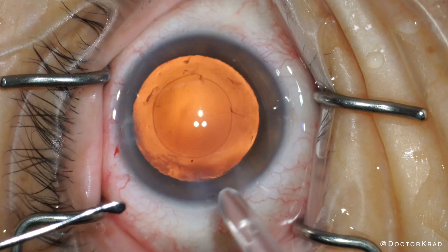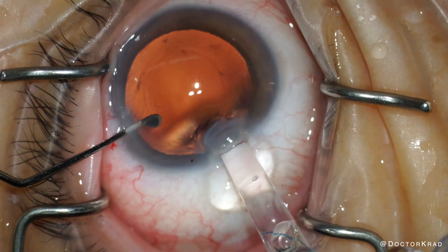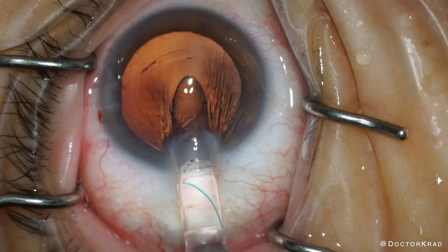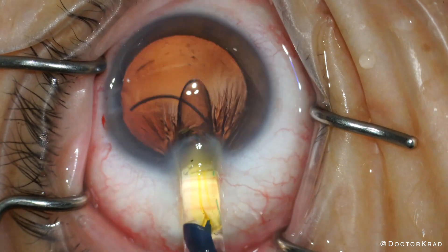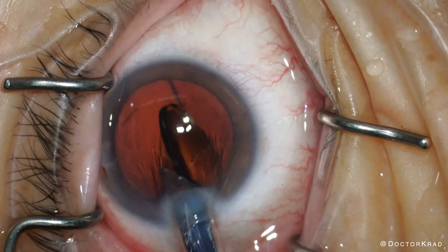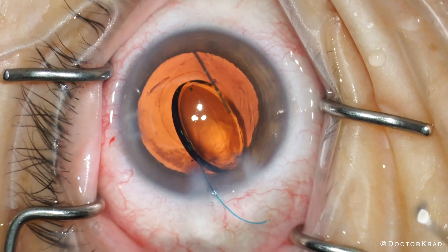But my issue with version 1 wasn't that it was difficult to load — I never actually thought it was difficult. Nuanced, sure, but not difficult. My main concern with the previous injector was that the lens didn't come out in a planar fashion. So let's see how the lens comes out with this new injector. Will it come out flat and planar, or will it go vertical? And to me, it went more vertical, just like the previous injector.